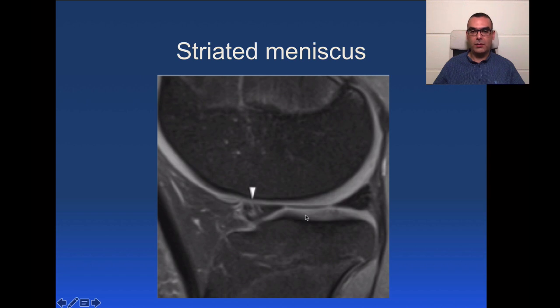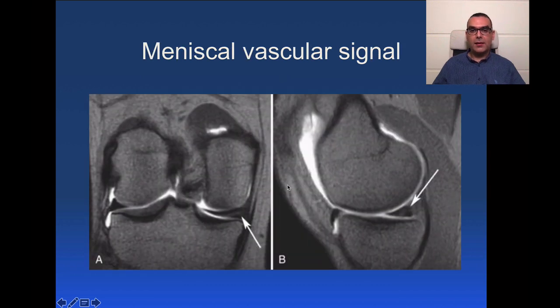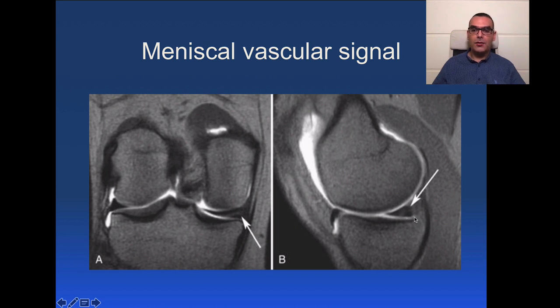These are the normal radial fibers of the meniscus. The second most common pitfall is the meniscal vascular signal. Before 25 years of age, slight hyperintensity within the meniscus, commonly at the base, always represents the meniscal vascular signal — the vascular supply of the meniscus. After 25 years of age, or with history of degeneration or trauma, you can call this a meniscal contusion or meniscal degeneration according to the clinical setting.